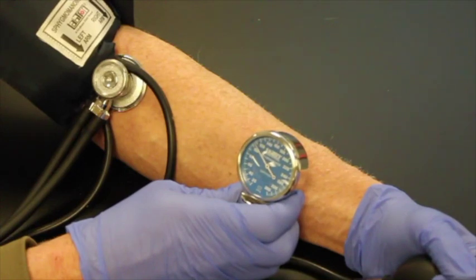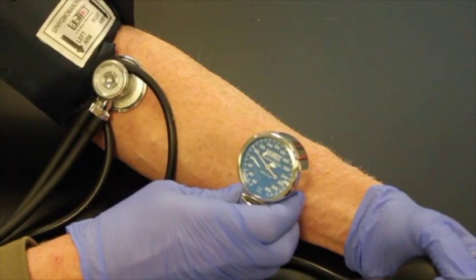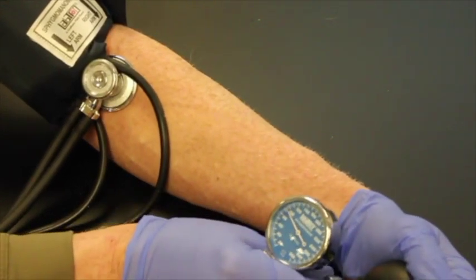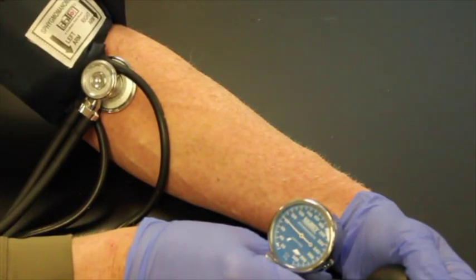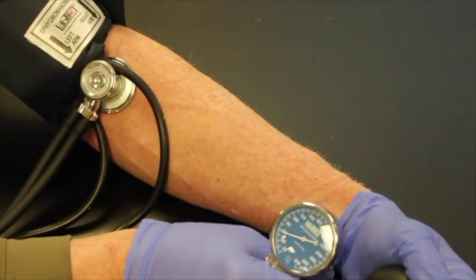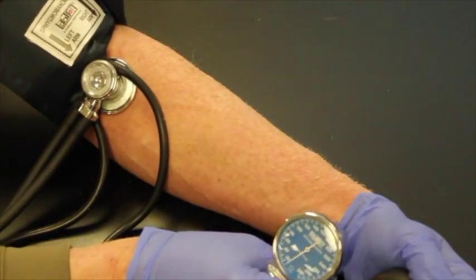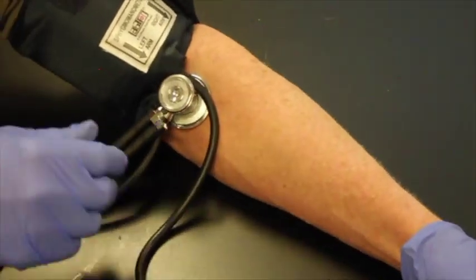And I keep going down, down, down, and it keeps going down until I can no longer hear that beat. And I just let it out. And that's how I take my blood pressure.